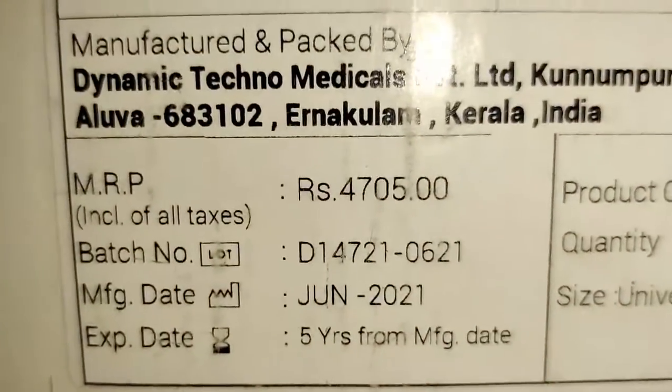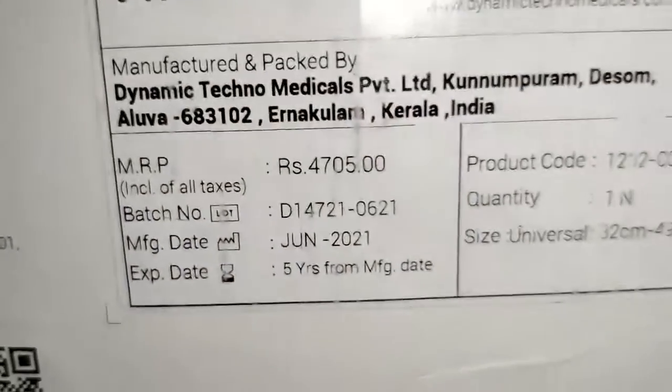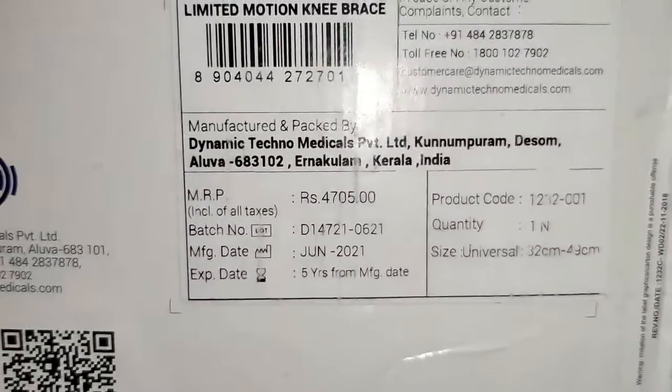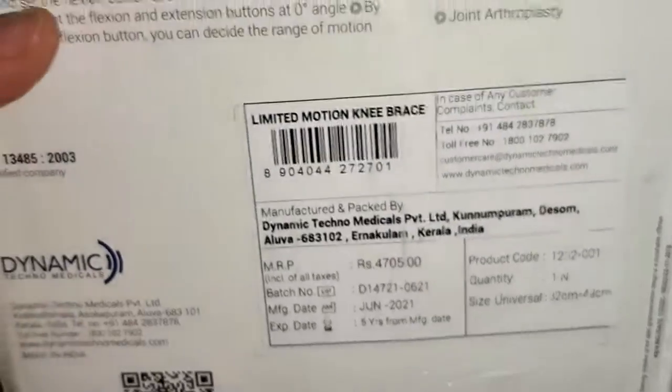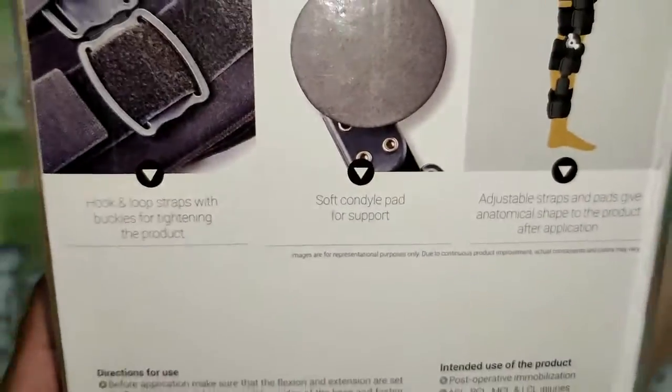The MRP printed is around 4705 rupees, but we purchased it for around 4000 rupees in a hurry. Don't get fooled — you can get this product at a 10 to 30 percent discount in the local market, so please do your research regarding that.